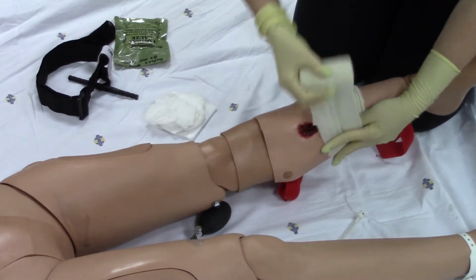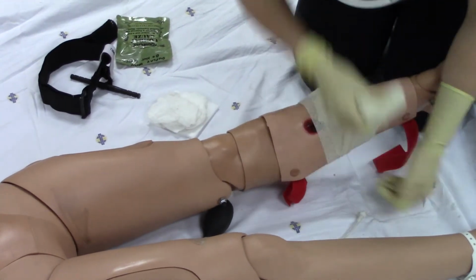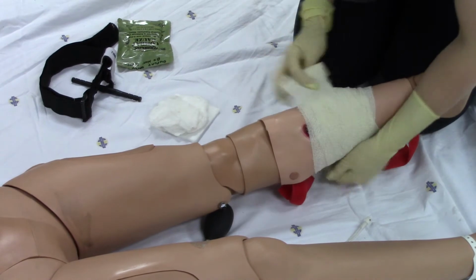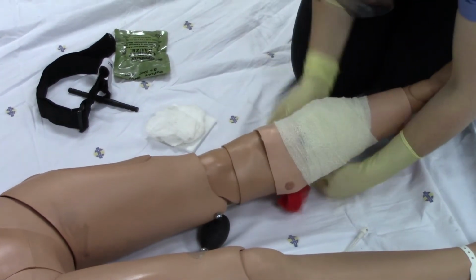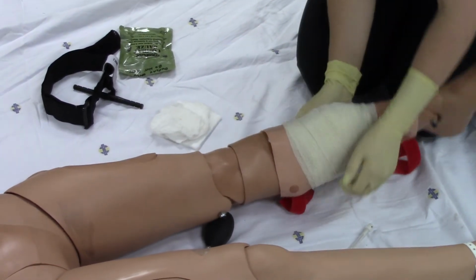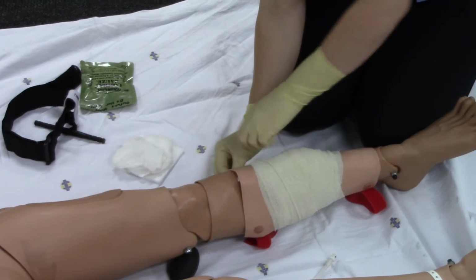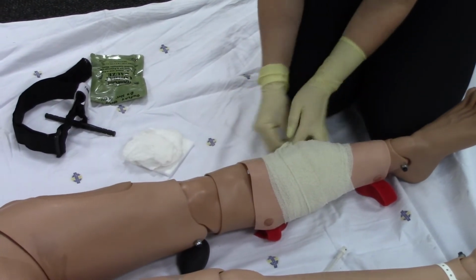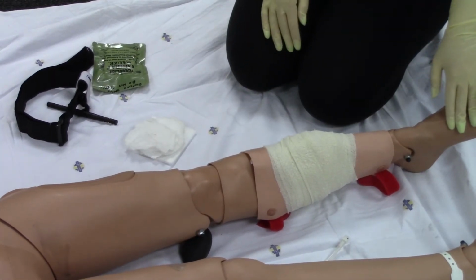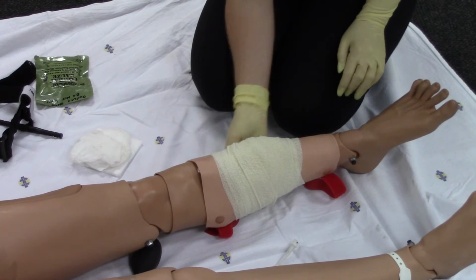Stretch the bandage enough to control bleeding. Ensure that if you are able to palpate a distal pulse before applying a dressing, that it is still palpable on the injured extremity after applying the dressing.